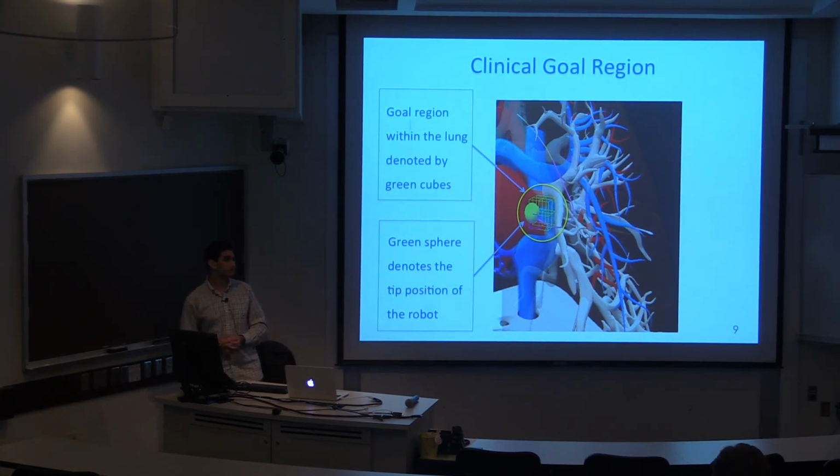Was your question from a medical point of view, what happened when you got there? I was just curious what type of information would be transmitted, like light or what type of signal, electromagnetic. Is there a camera at the tip, or is it taking a biopsy? Once it's in, is there a camera on the end of the tube?